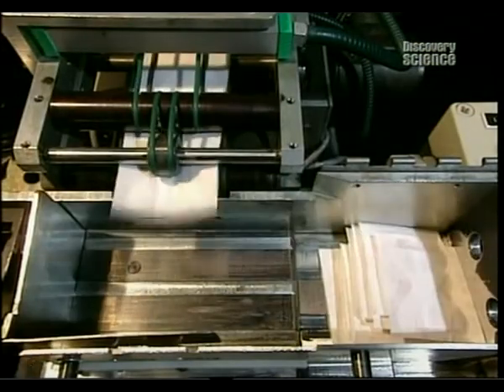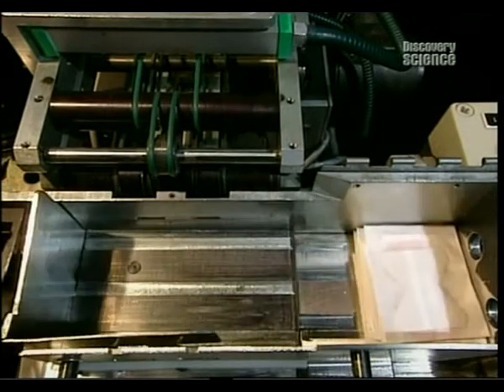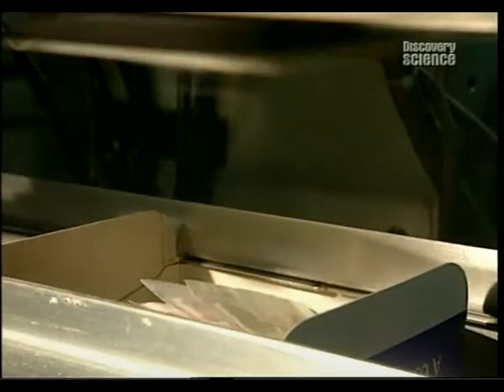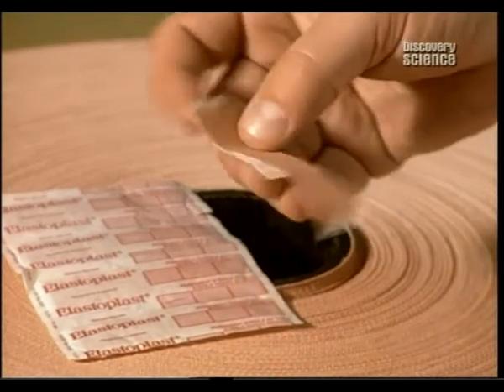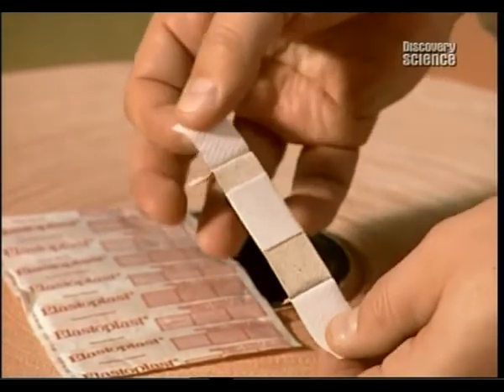The plasters are automatically counted and placed in a chute and fall into the packaging box. The large roll of ETS fabric seen at the beginning will have produced nearly 2 million bandages. Each year, this factory produces a staggering 4 billion bandages in 65 different models.